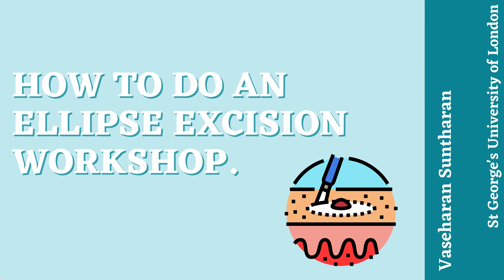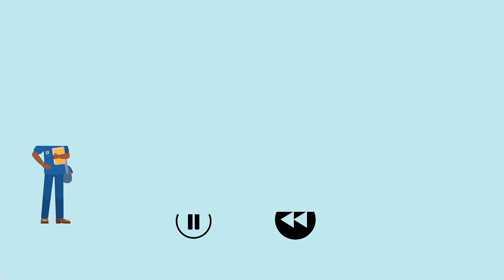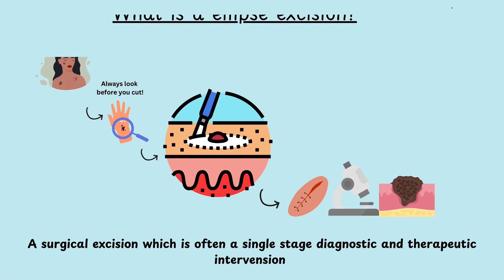This video will show you how to do an elliptic excision as a workshop. The goal is to create a safe and effective way to learn and practice an elliptic excision in a cost-effective and accessible way. I would recommend pausing and rewinding the video when needed. An elliptic excision is a surgical excision which is often a single-stage diagnostic and therapeutic intervention — meaning we're taking out the queried lesion and examining it under a microscope.